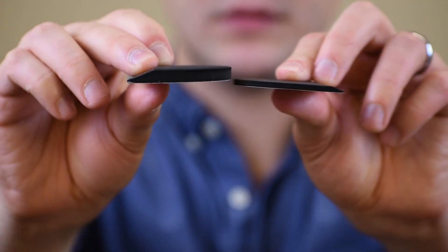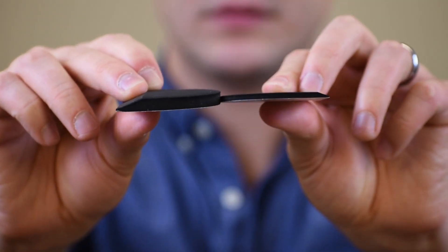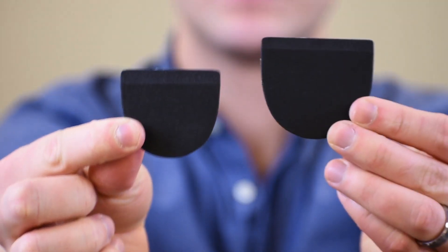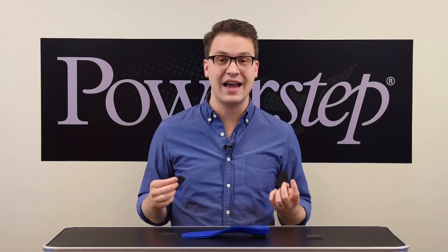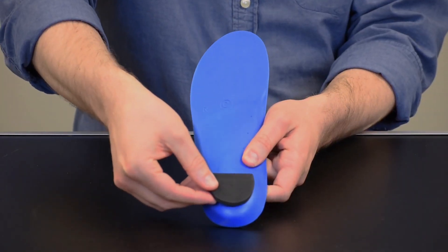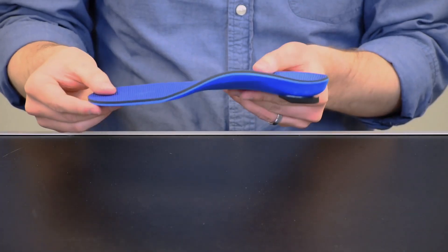Heel lifts are used to correct leg length discrepancy. These come in two different heights: ¼ inch and ⅛ inch. Each height comes in two sizes — small for most women's sizes and large for most men's sizes. Heel lifts can also be stacked if necessary. Remove the backing, apply firmly to the underside of the heel, and adjust to comfort.